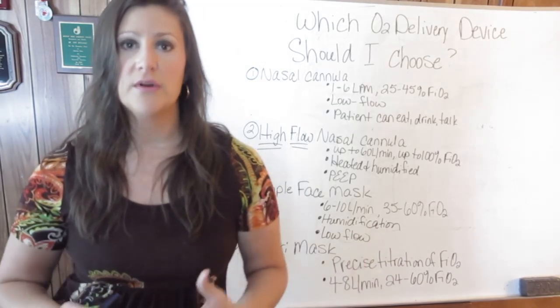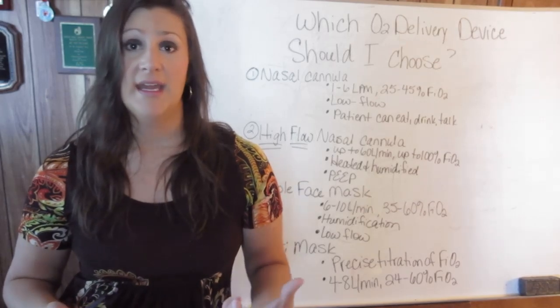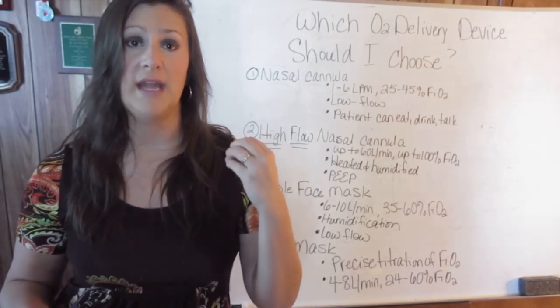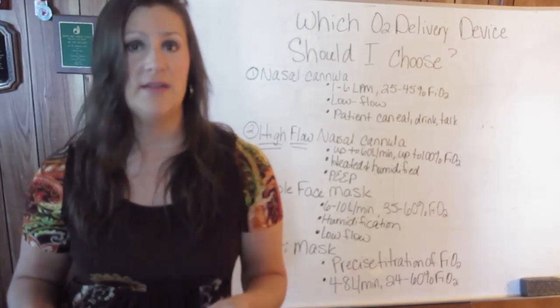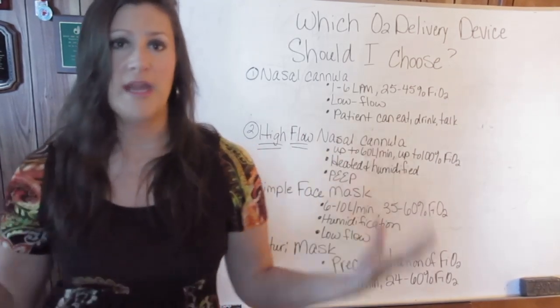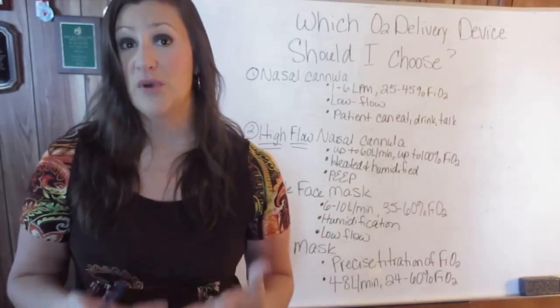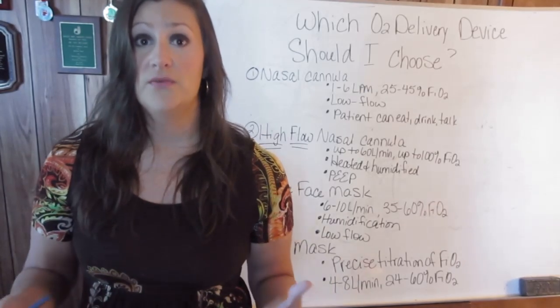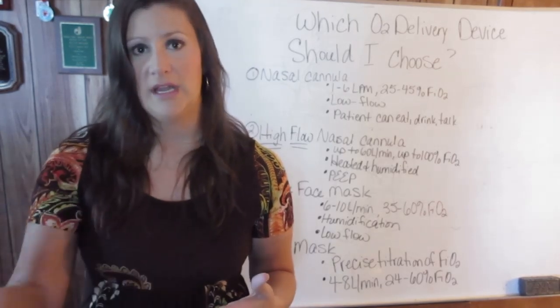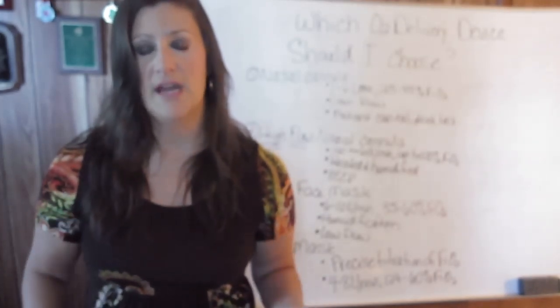So with the non-rebreather, you want to make sure that that bag is fully inflated, and you've got to remember that it is only a short-term fix. You cannot leave a patient on a non-rebreather mask for 24 hours or 2 days or whatever. If someone is sick enough to need a 100% non-rebreather, then they're sick enough that they're about to need something more invasive, intubation and mechanical ventilation. So non-rebreather, very short term, it is still considered a low flow device.